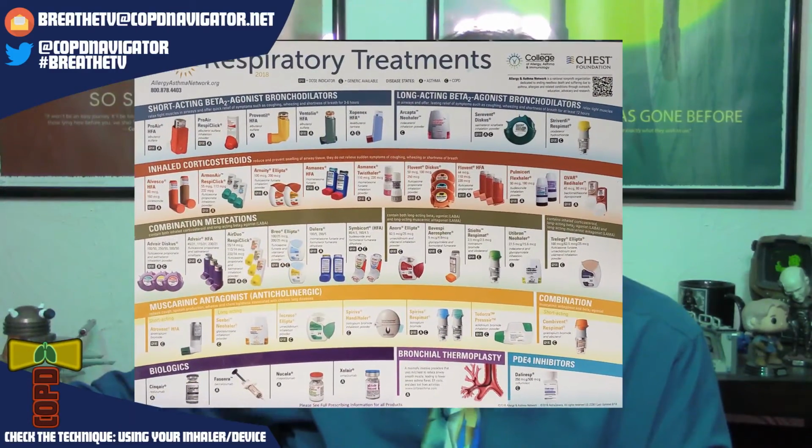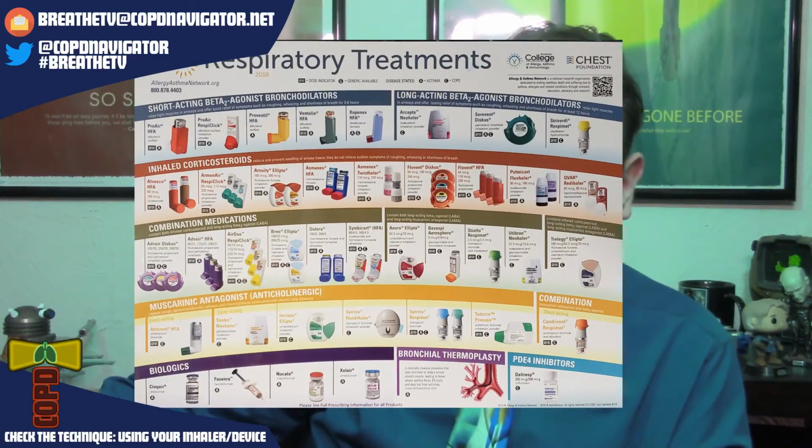This is a device made by a company called Boehringer Ingelheim. There we go. Looks like a little torpedo. Basically what that does is it's very similar to our traditional metered dose inhalers, except instead of using a chemical propellant, it uses a spring and actually forces liquid through some very laser-drilled nozzles and creates a slow-moving mist. Does tend to work fairly well, again, in the right person. The trade-off on the Respimat is that it can be a little bit difficult to twist. When you turn it, instead of pressing it in, you've got to turn it in order to actually tension the spring. That can be a little bit tricky.